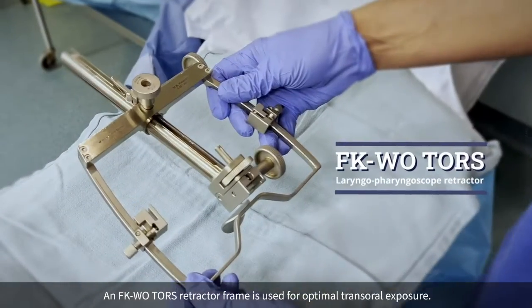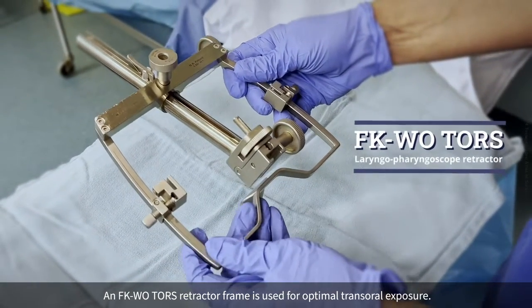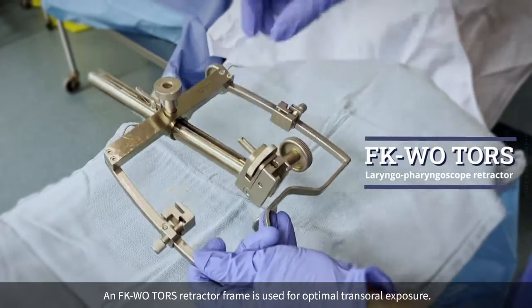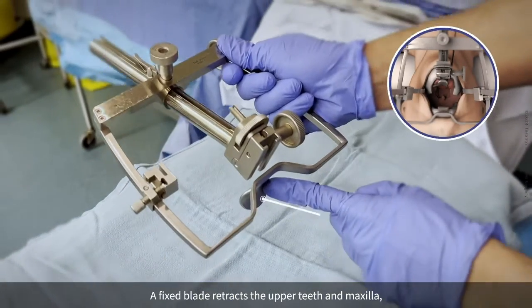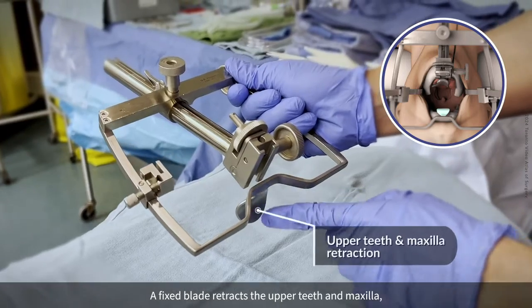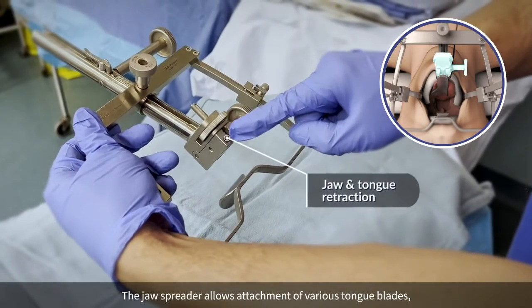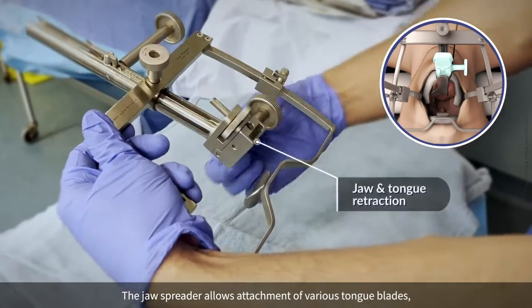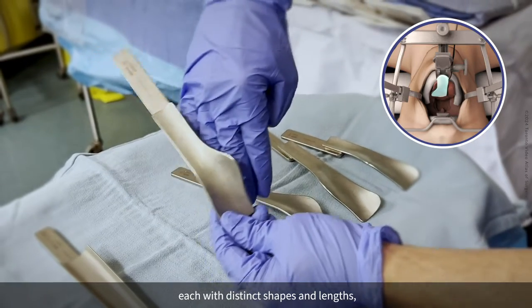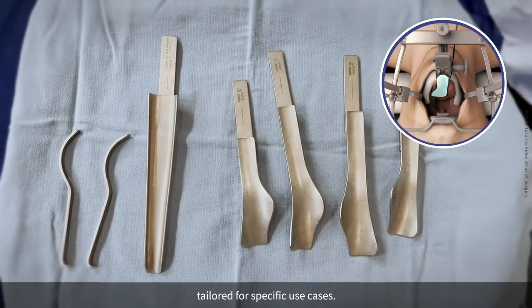An FKWO TORS retractor frame is used for optimal transoral exposure. A fixed blade retracts the upper teeth and maxilla. The jaw spreader allows attachment of various tongue blades, each with distinct shapes and lengths tailored for specific use cases.